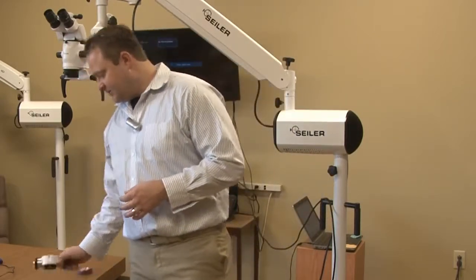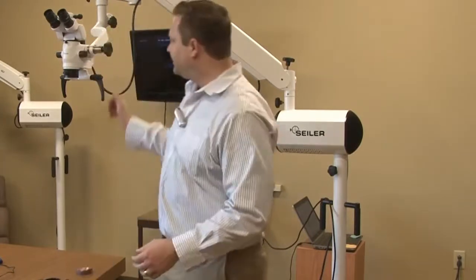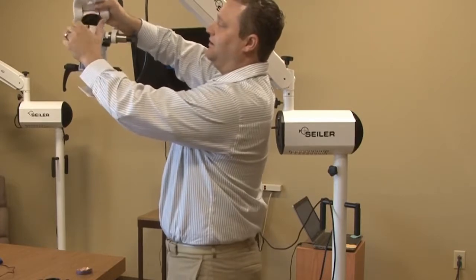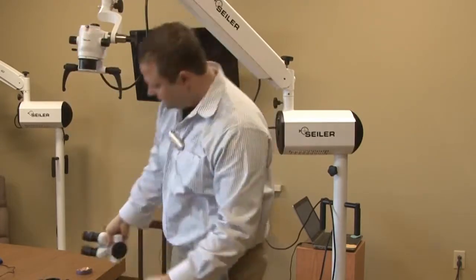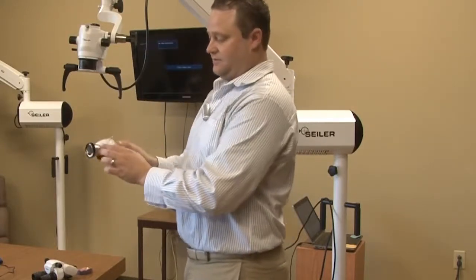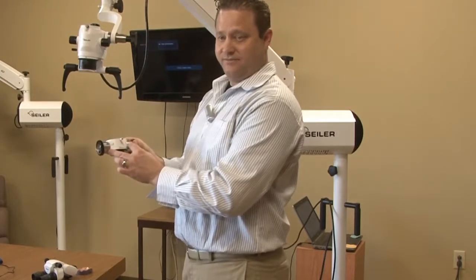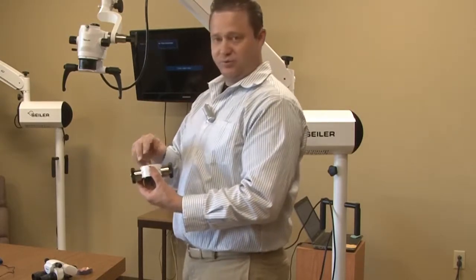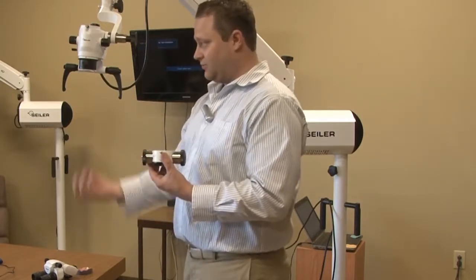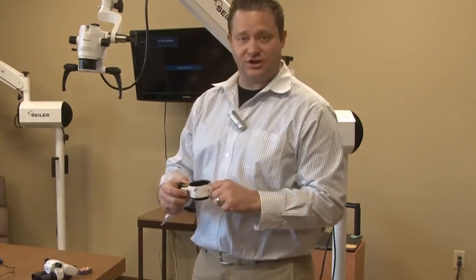Of course, you're going to need the beam splitter. The beam splitter is going to go in between the optical pod and the binocular head. So you remove the head and we're going to put the beam splitter on. We have two different ports: a 50-50 and a 20-80. What that means is we have two individual prisms — 100% of the light is going to be going down through the optical path. It's all coaxial illumination, so it's completely shadow free.